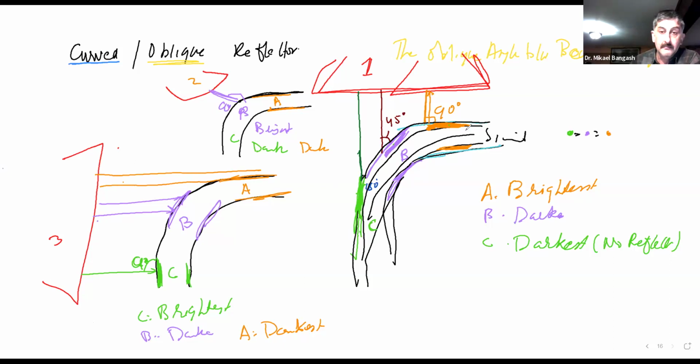It depends on whether the brightness of the reflections changes as we slightly maneuver the transducer to scan from different angles or not. Did you guys get that? Any questions?